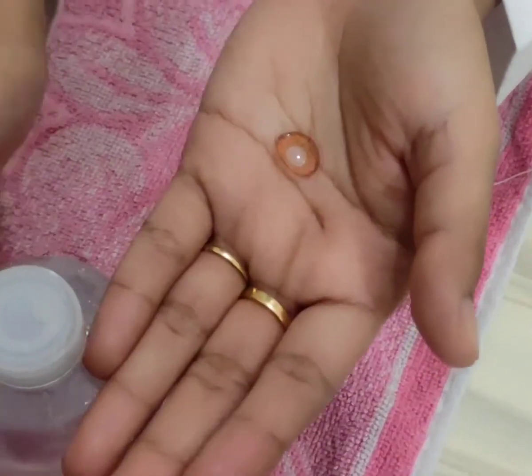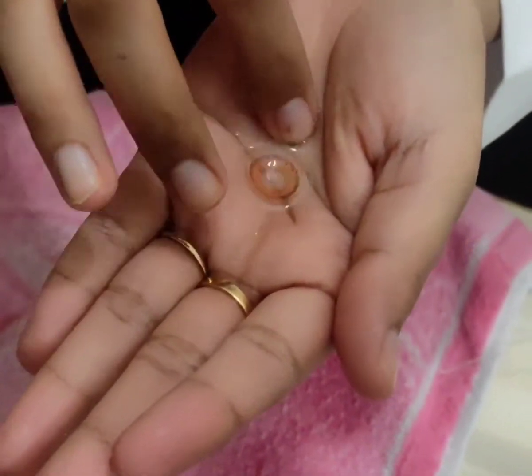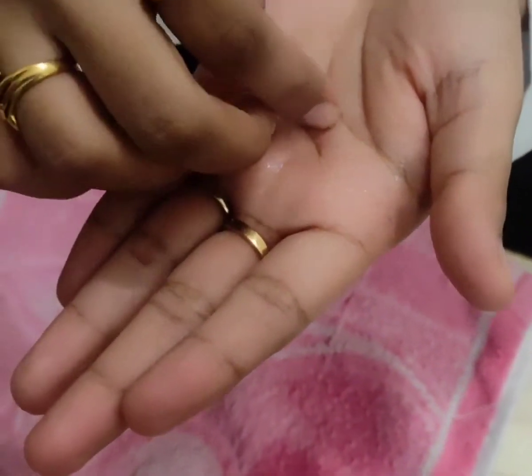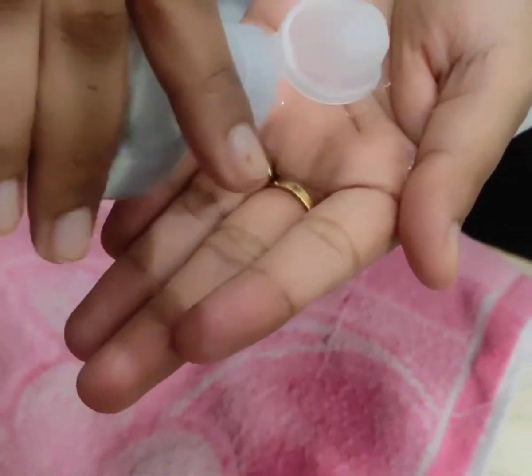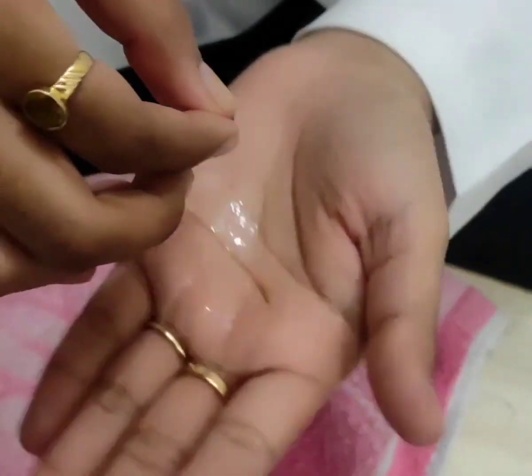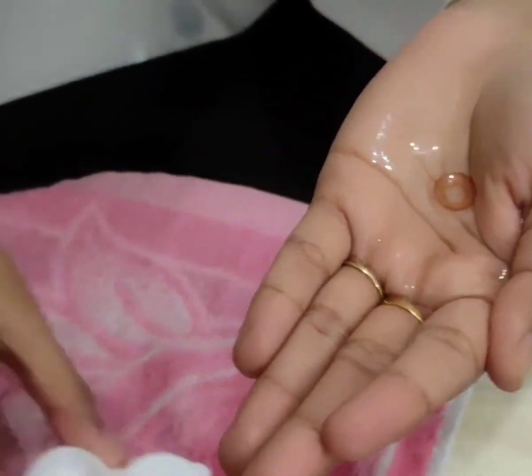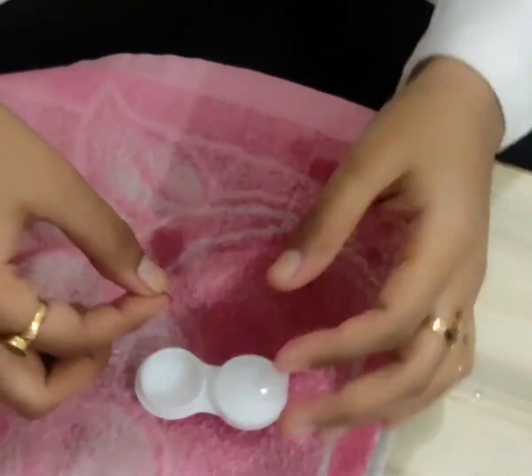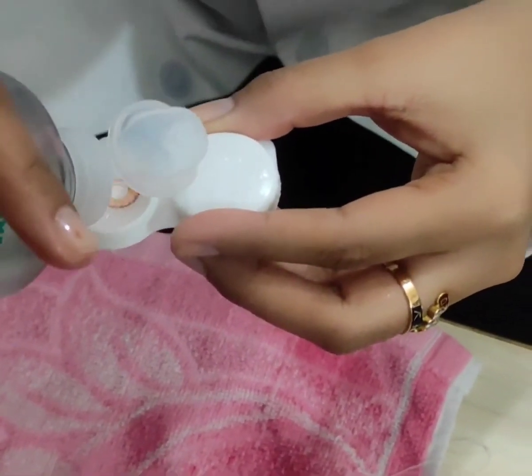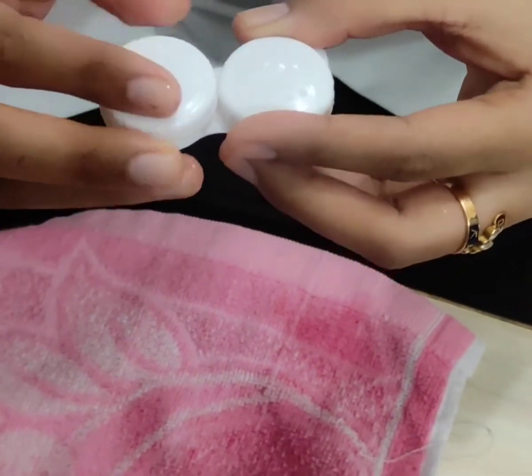After removing the lens, place it in the palm of the hand. Place a few drops of cleaning solution on the lens and rub the lens to and fro with the index finger for about 10 seconds. Repeat this procedure twice again using the cleaning solution. Rinse the lens properly. Now put the lens into the lens case with fresh disinfecting solution, and then finally close the lid of the lens case.